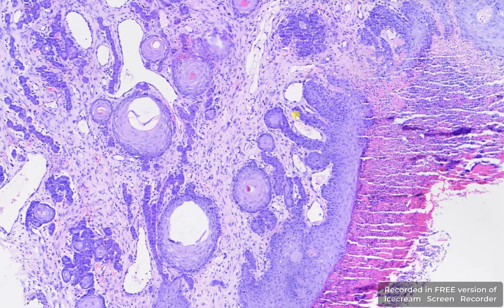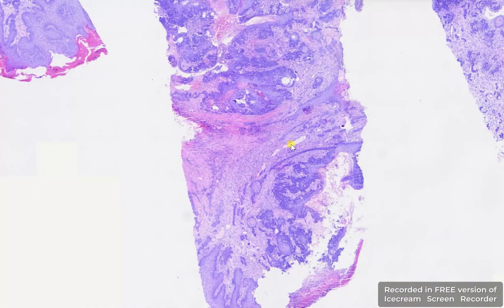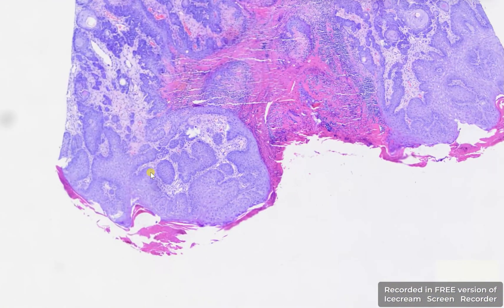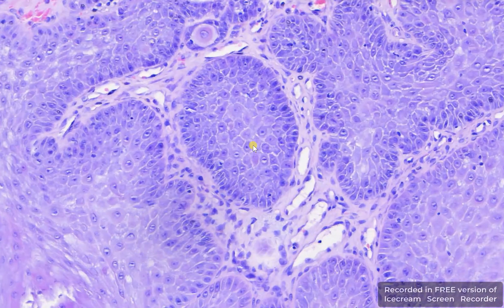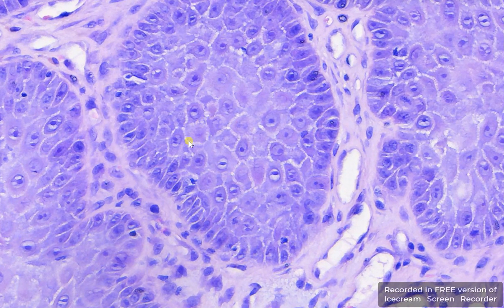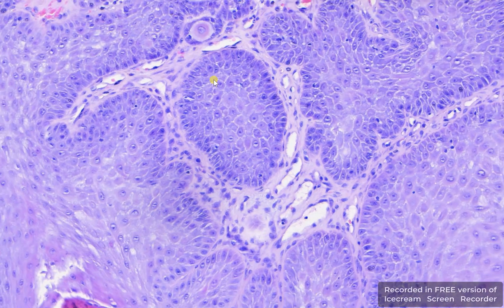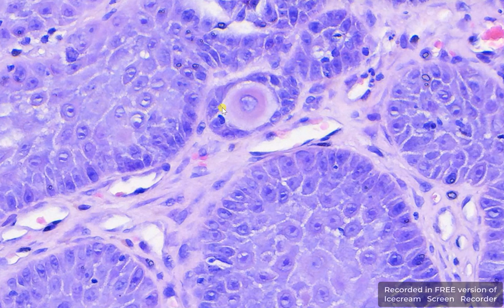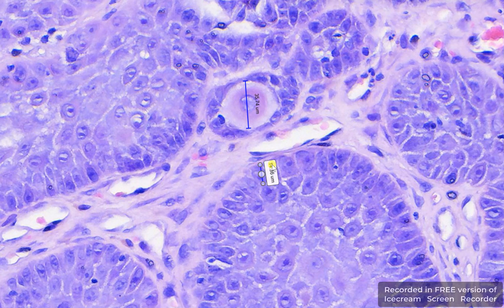In another area of this tumor, you can see very nicely the very prominent intercellular bridges and the intercellular spaces, so the cells are very well defined. Last but not least, here you can see one single cell which has a very large diameter of 35.74 micrometers, compared to other epithelial cells which are only 14.36 micrometers.